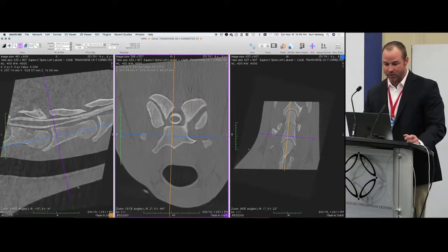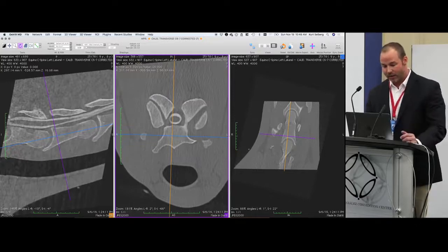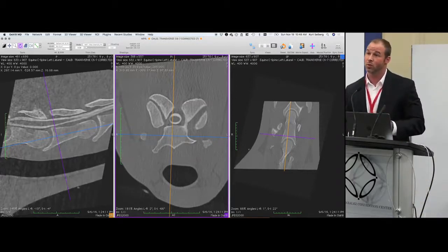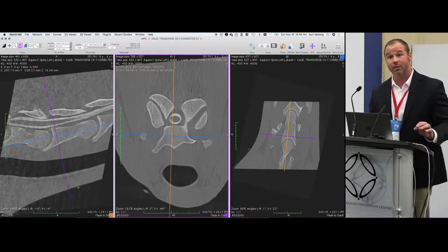And so some of that is bony stenosis, but there's also a soft tissue component that comes in along the more lateral aspect of the spinal canal and narrows the subarachnoid space. And we can see that sitting right down here a little bit more. All of those things, as a perfect storm, will contribute to our narrowing. This lateral compression, you're just not going to see that in your standard myelographic studies.